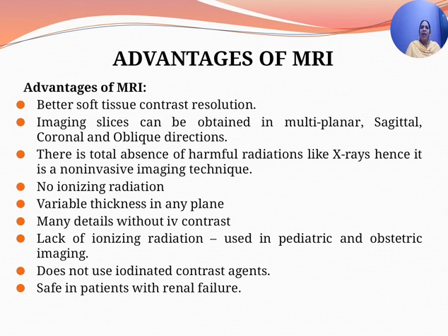There is a total absence of harmful radiations like X-rays. Hence, it is a non-invasive imaging technique. No ionizing radiation is required.